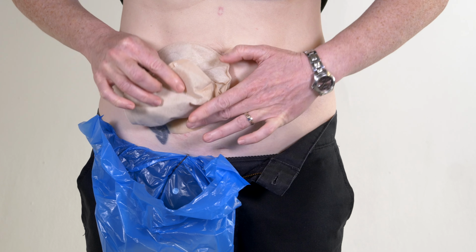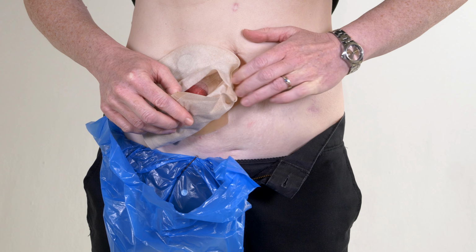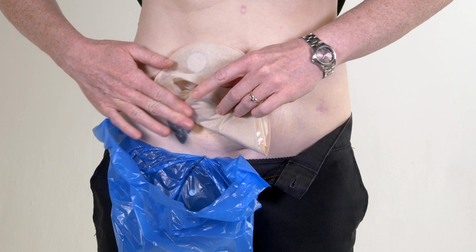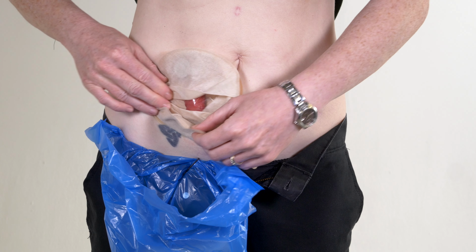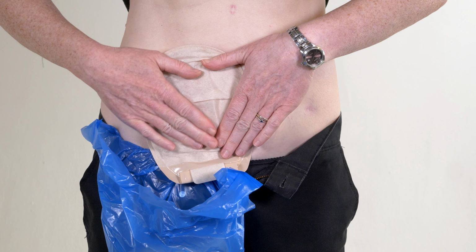Apply the pouch from bottom to top. Gently press the adhesive down around the stoma first, then smooth it outwards toward the edges. Take your time and massage out any creases that could lead to leaks.